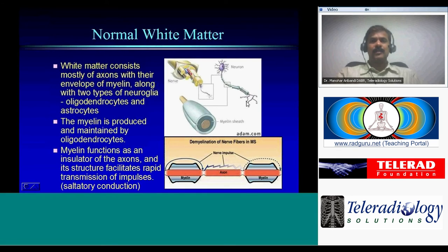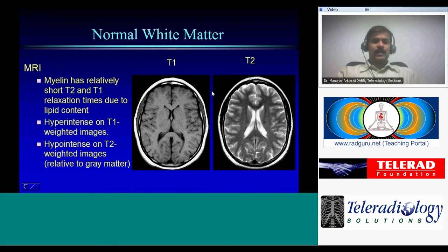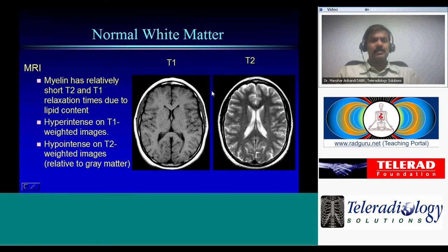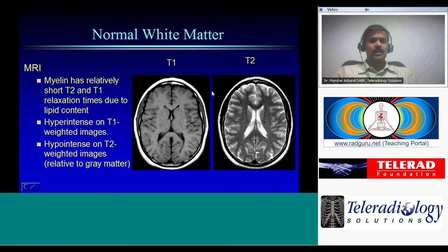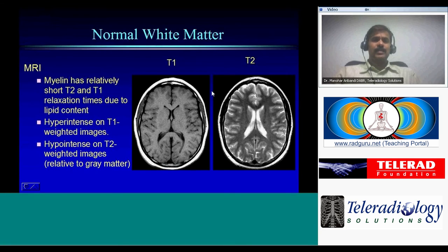On imaging, we'll mostly talk about MRI, as CT is not very sensitive for white matter abnormalities. On MRI, myelin has relatively short T1 and T2 relaxation times due to the presence of lipid, giving hyperintensity on T1-weighted images and hypointensity on T2-weighted images relative to gray matter. Gray matter has more water content, so it is hyperintense on T2.